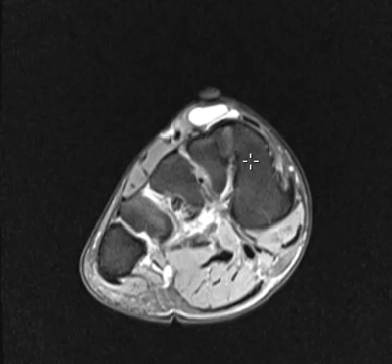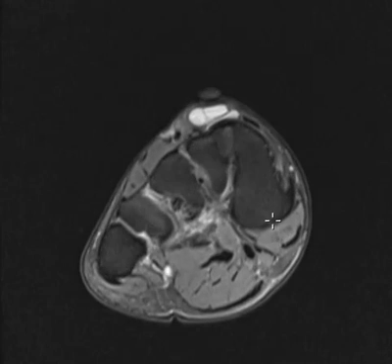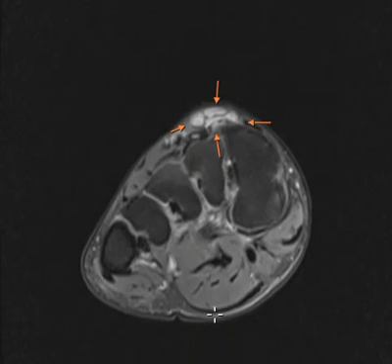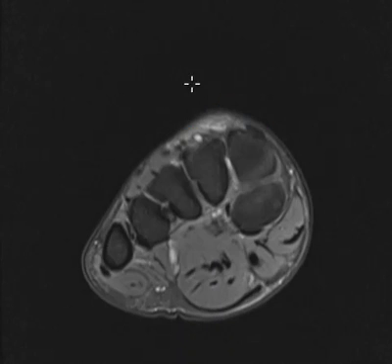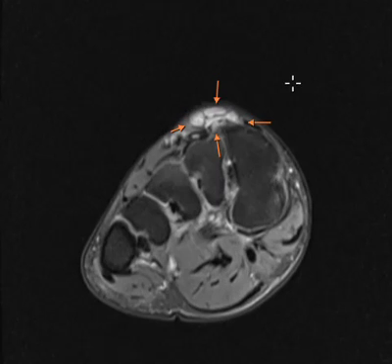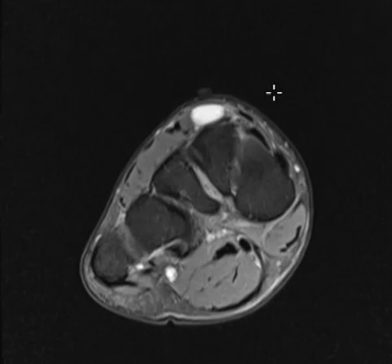Now we can see this on other views. You have three different planes we look at. This is called the axial plane. This is the outside, this is the inside — the medial side. This is the plantar side — the bottom. This is that dorsal foot. You can see these little internal septations there, and then back here there's a more clean collection.